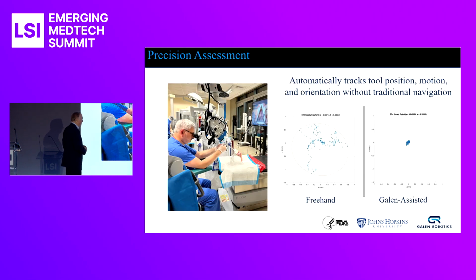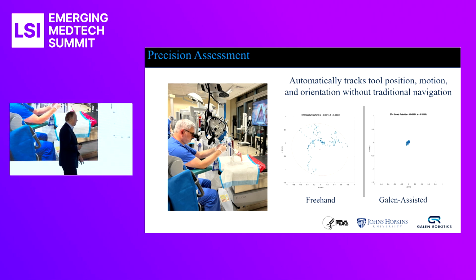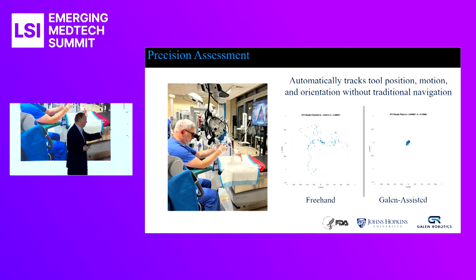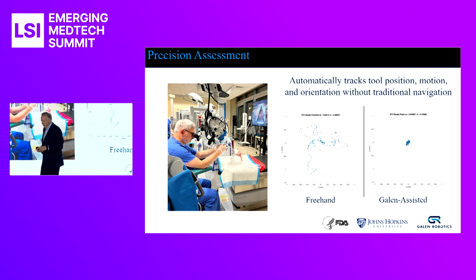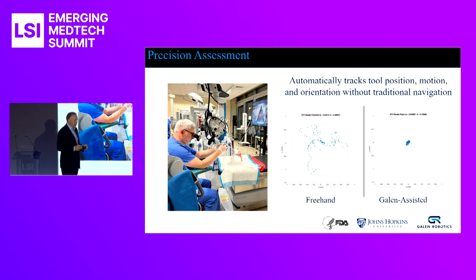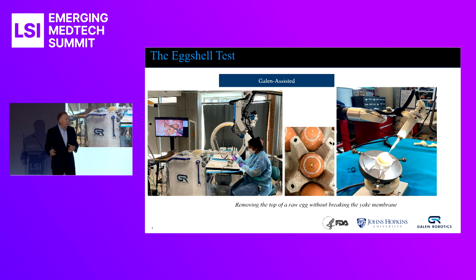So this is what it all ends up to be. You take the same tool that Dr. Ask is here using, and for example, we asked 100 surgeons to touch the red dot. This is basically heartbeat and tremor. And they'll say they have a heartbeat, they'll never say they have a tremor. But you hook up the robot to their tool, all of a sudden touch the red dot again, and this gives them quickly what they can do that they couldn't do before.